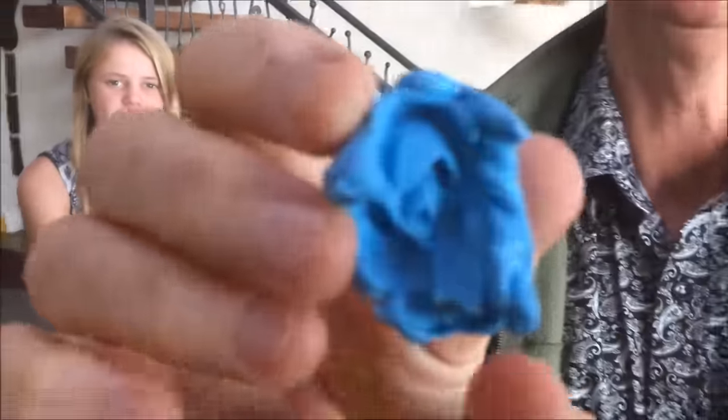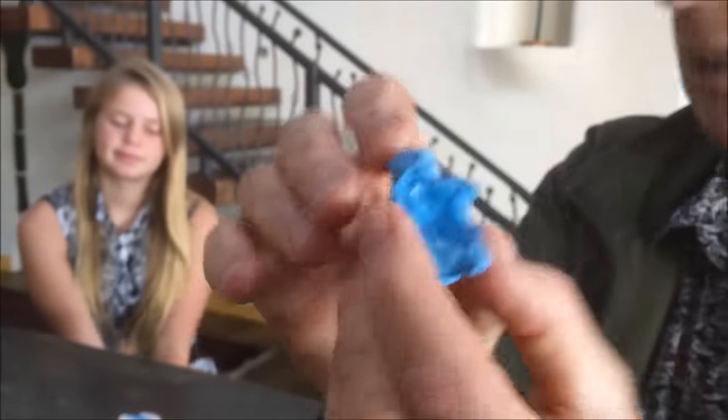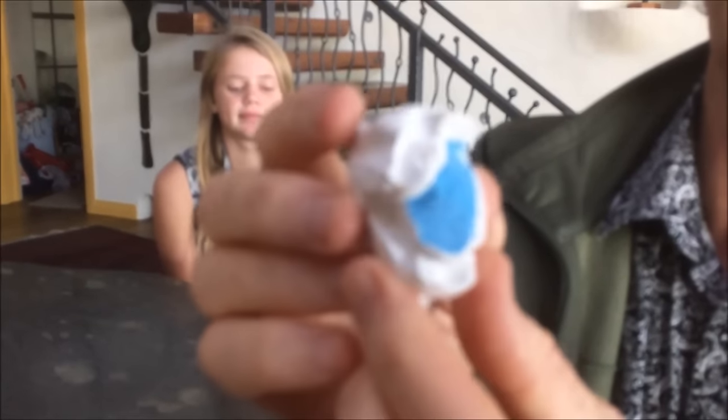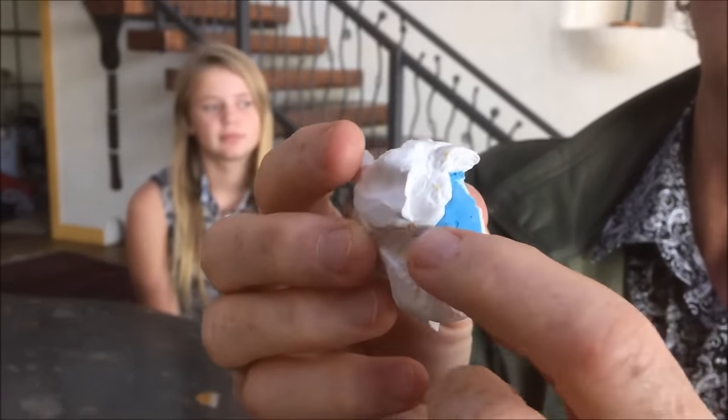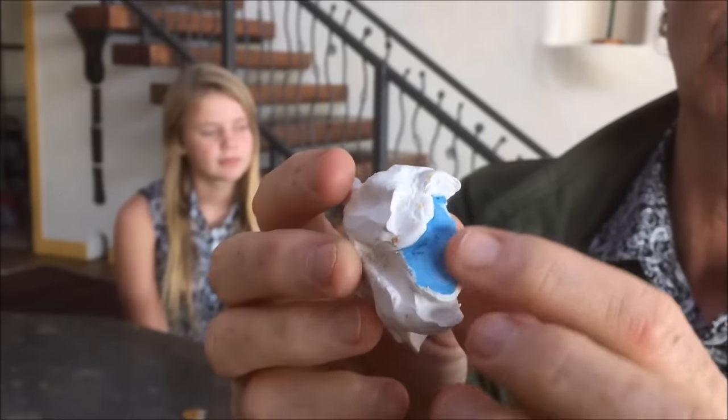I'm Kayla's dad, Simon McDonald. I used to be a dentist — I've retired from that. But here is an impression we took of Nibbles' beak — we'll bring it close so you can have a look. We then poured plaster into that and made a plaster model. I also added some silicone rubber around there to make a spacer for Nibbles' tongue.